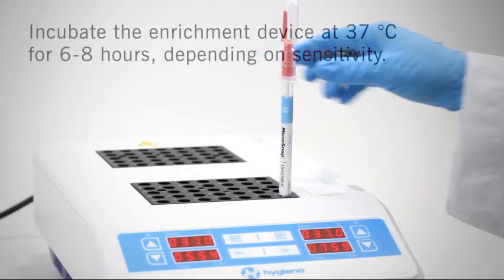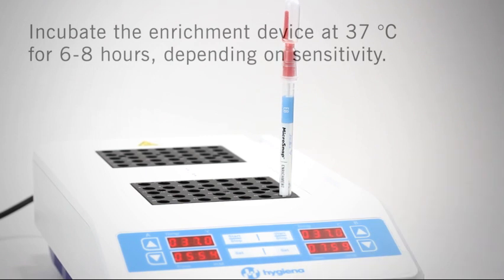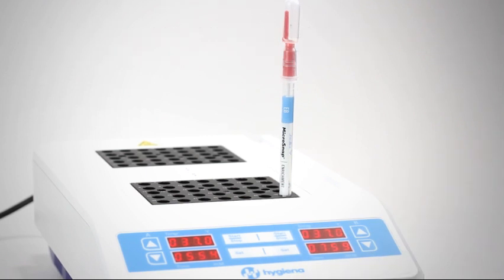Shake the tube gently to mix the sample with the enrichment broth. Incubate the enrichment device at 37 degrees Celsius for 6 to 8 hours depending on the sensitivity required for your sample.